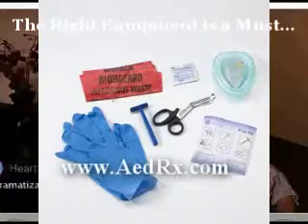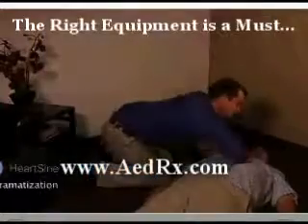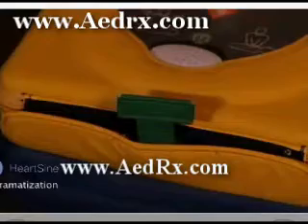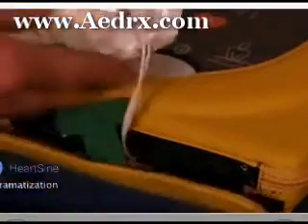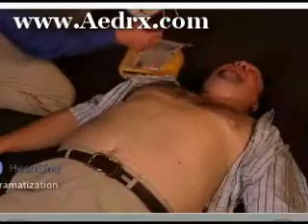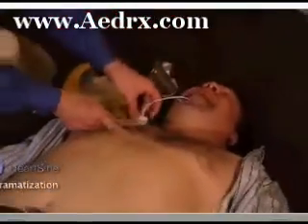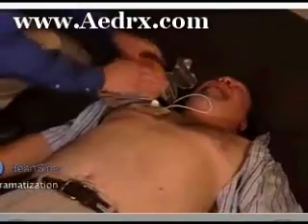Remove clothing from patient's chest to expose bare skin. Pull green tab to remove pads. Peel pads from liner. Apply pads to patient's bare chest as shown in picture.